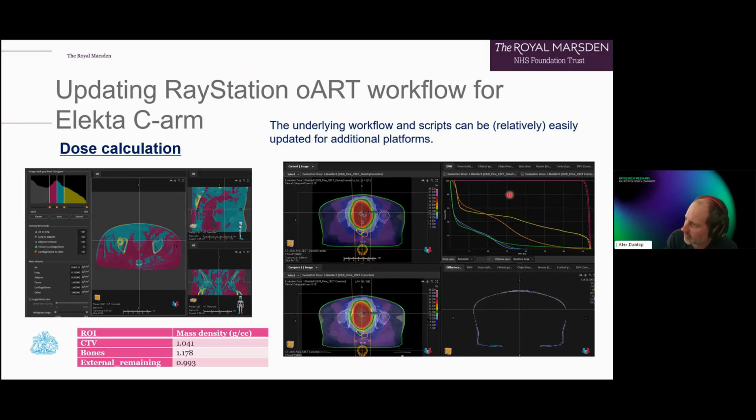In terms of validation of the corrected cone beam CT algorithm, it's slightly trickier because the underlying image quality is not quite as good, so it's harder to get a ground truth. But we were able to leverage years of bulk density override approaches on the MR-linac to get our ground truth for this, and found that the corrected cone beam CT is still working really nicely here.